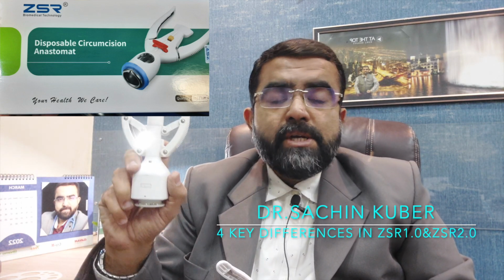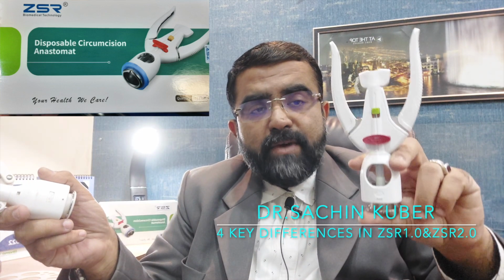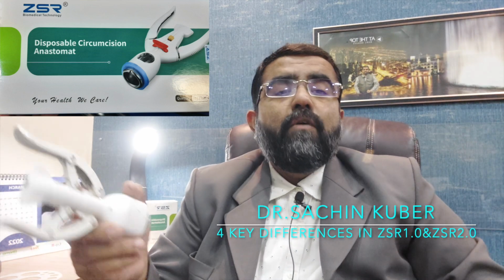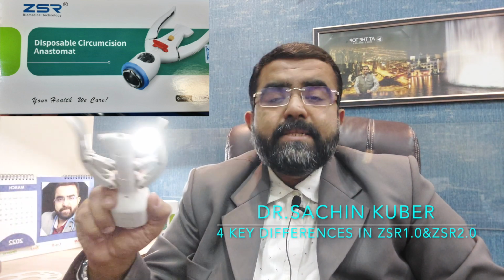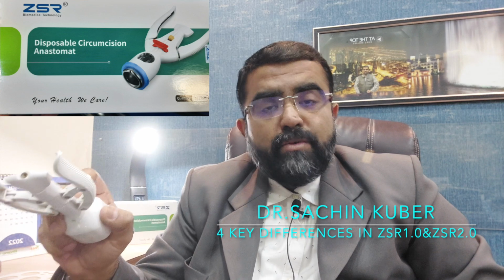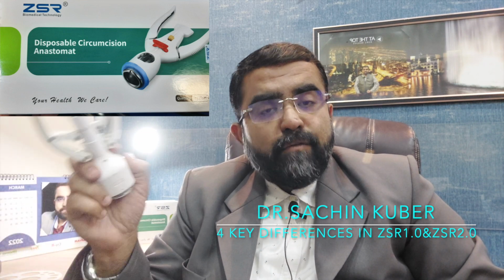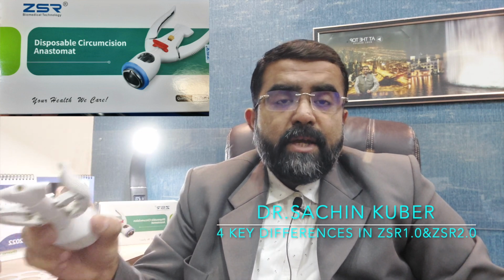which has to be used for normal cases, normal circumcision for phimosis where complications are not there. And this special device, the second generation device, can be used for more complicated cases: BXO phimosis, fungal infection, balanitis, balanoposthitis, so many complications are there. For those complicated cases, it can be used.